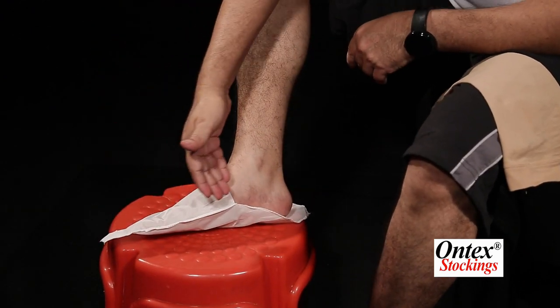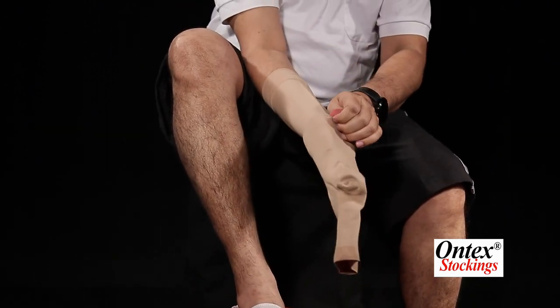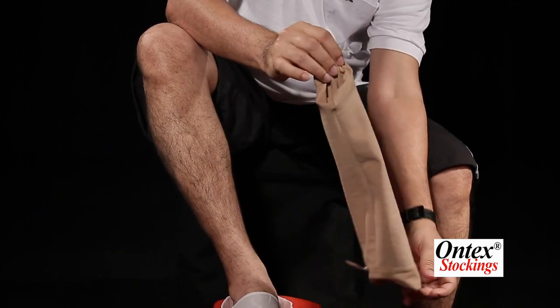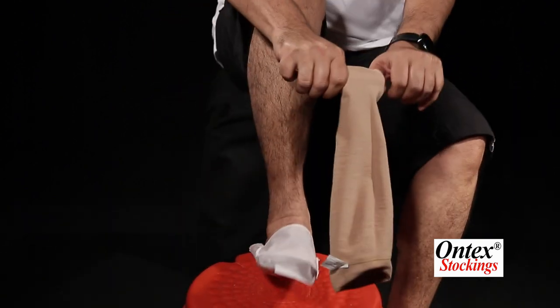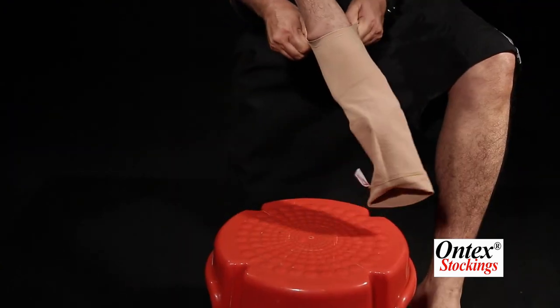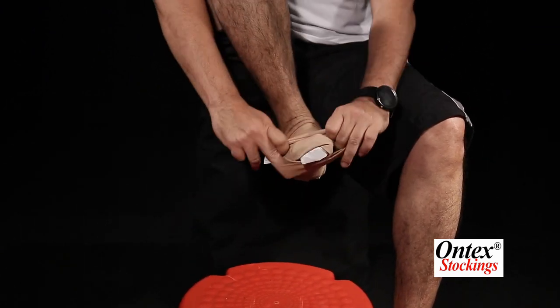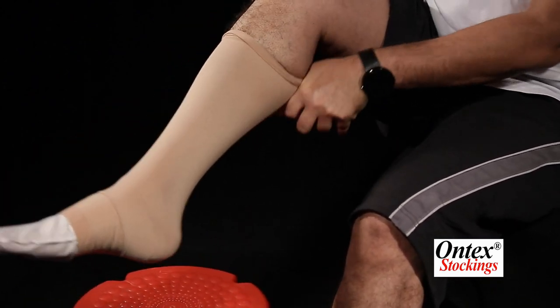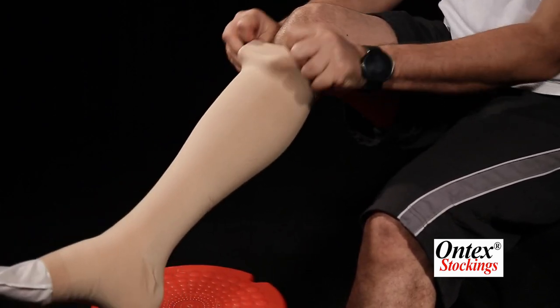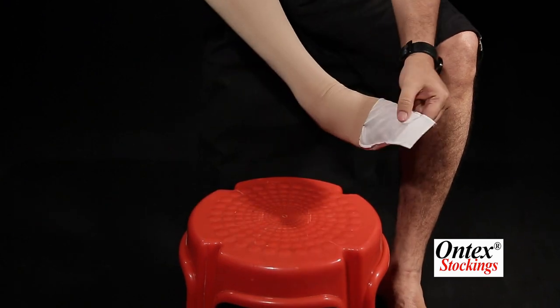This is a slip-on. Put your hands inside, hold the heel pocket and reverse it like this — don't lose this hold. Now gently apply it and pull it up to the heel, then hold it and pull it up. If there are any wrinkles, just smoothen them, and then you can remove the slip-on device.